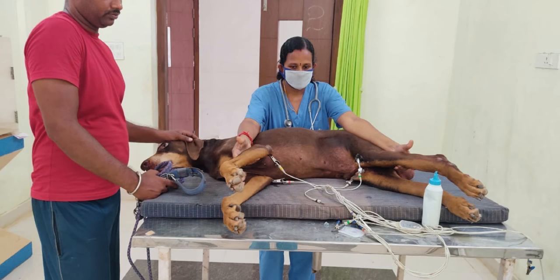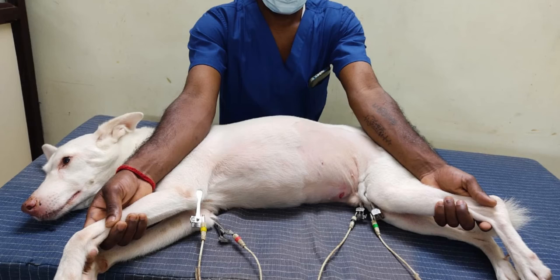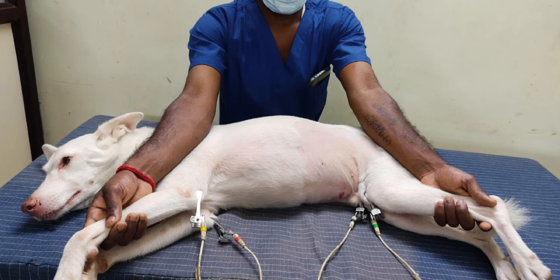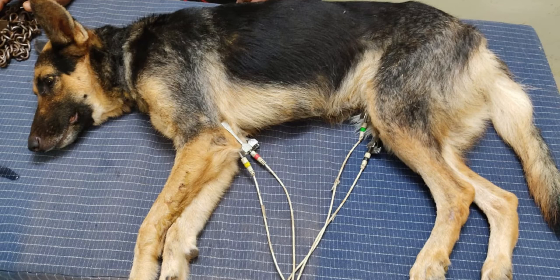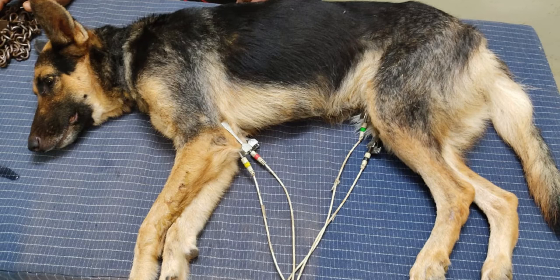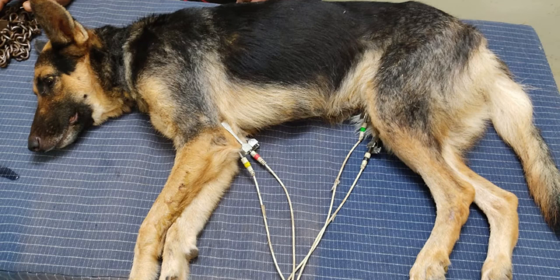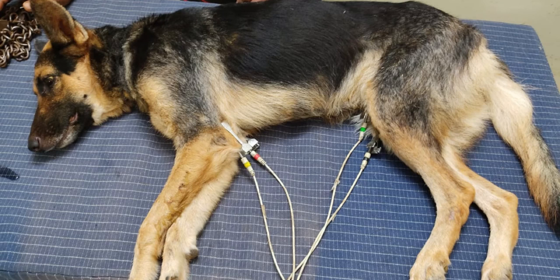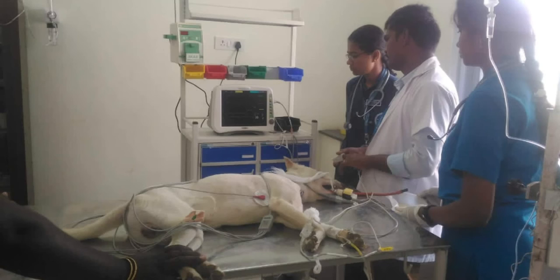Place the limb electrodes on the patient as labeled — each electrode should be labeled with the limb to which it is attached. Each electrode is color coded and placed as follows: left arm is yellow, right arm is red, left leg is green, and right leg is black. The color code is optional.